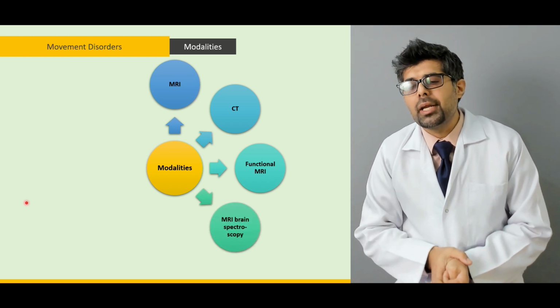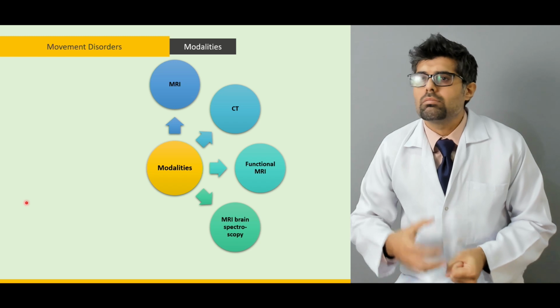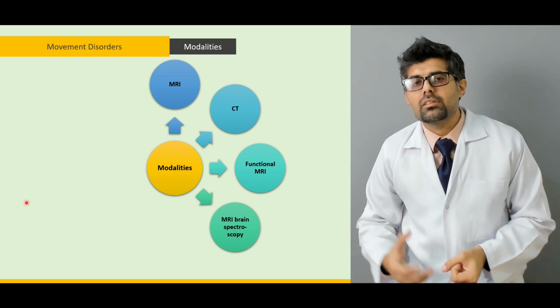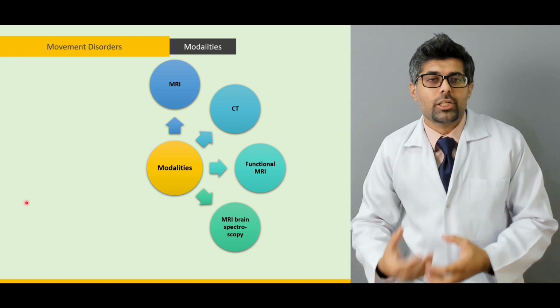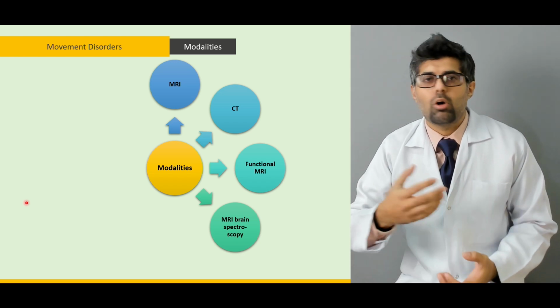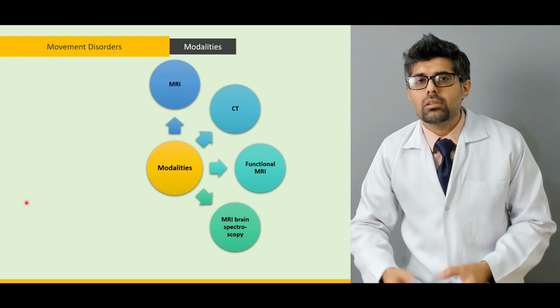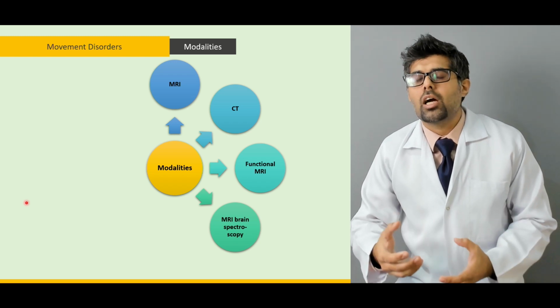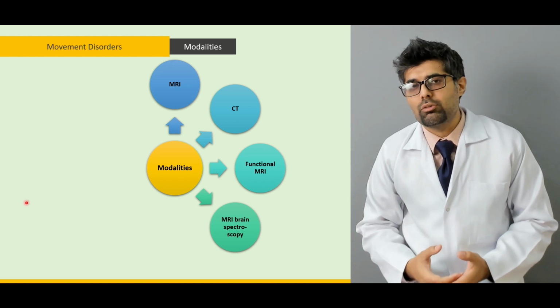Next is the MRI brain spectroscopy. Now, this is of very little interest in neuroimaging, but it is still used. What happens is that during the MRI, again, a live feed of the patient's brain is projected on a monitor, and the doctor observes that particular image and all the slices along with it, with all the particular phases and windows. But neurons, whenever they transmit an impulse, produce certain kinds of signals, and these signals are picked up on the spectroscopes.